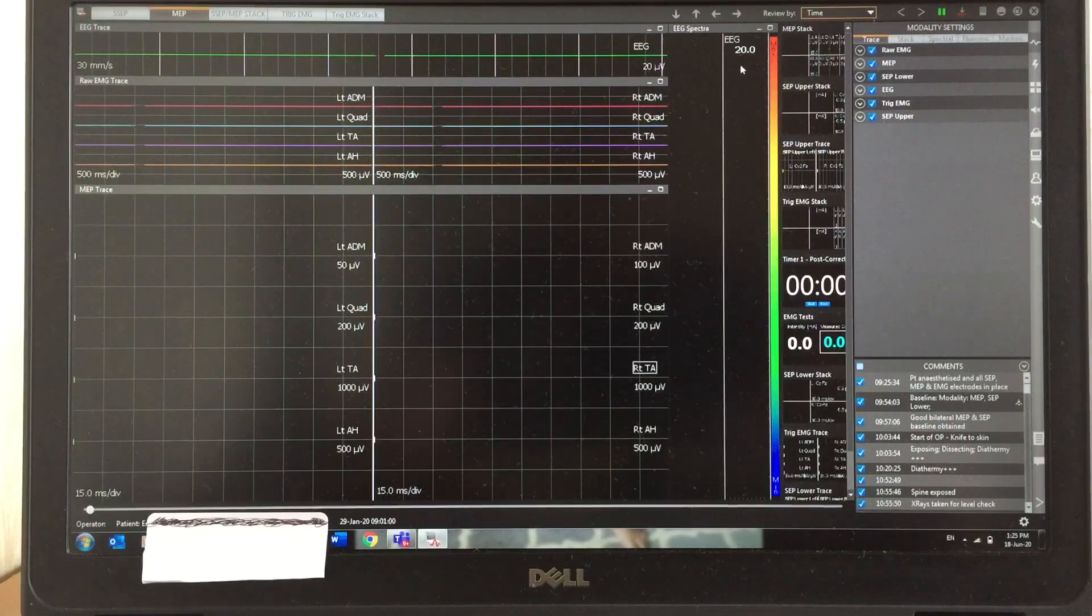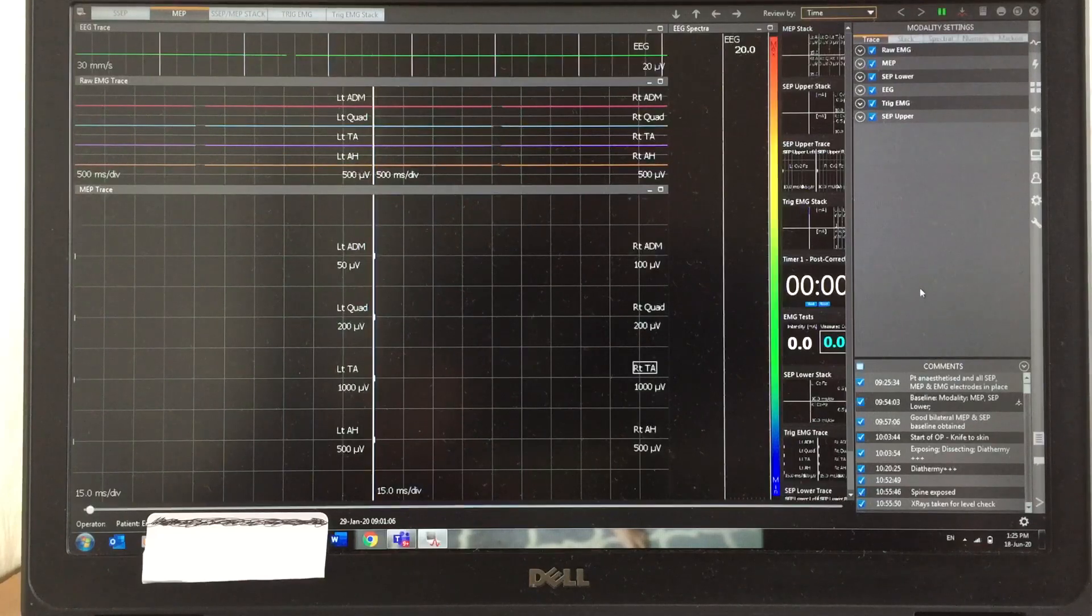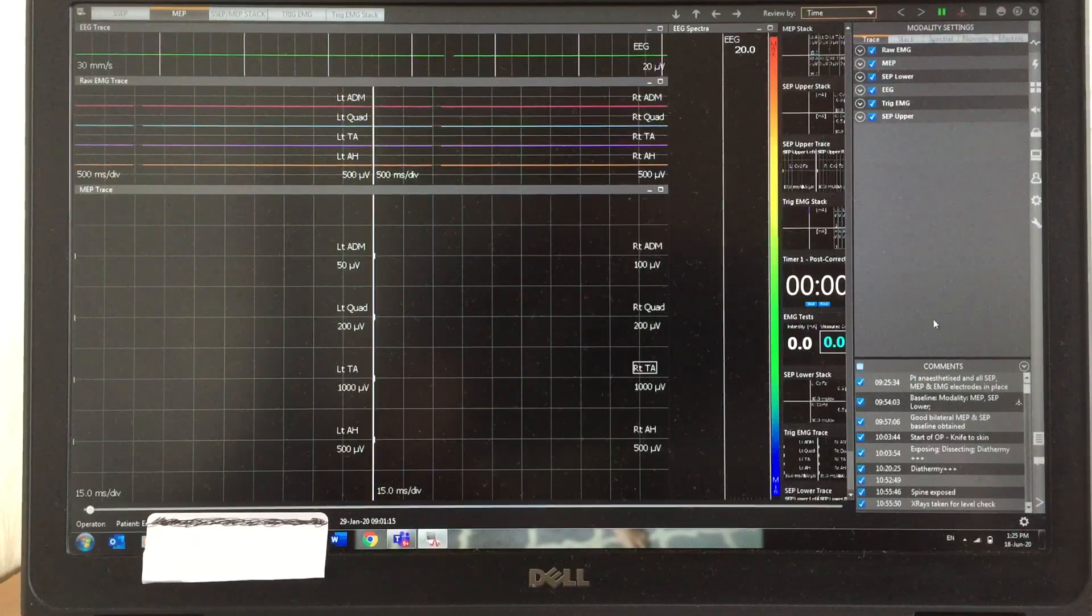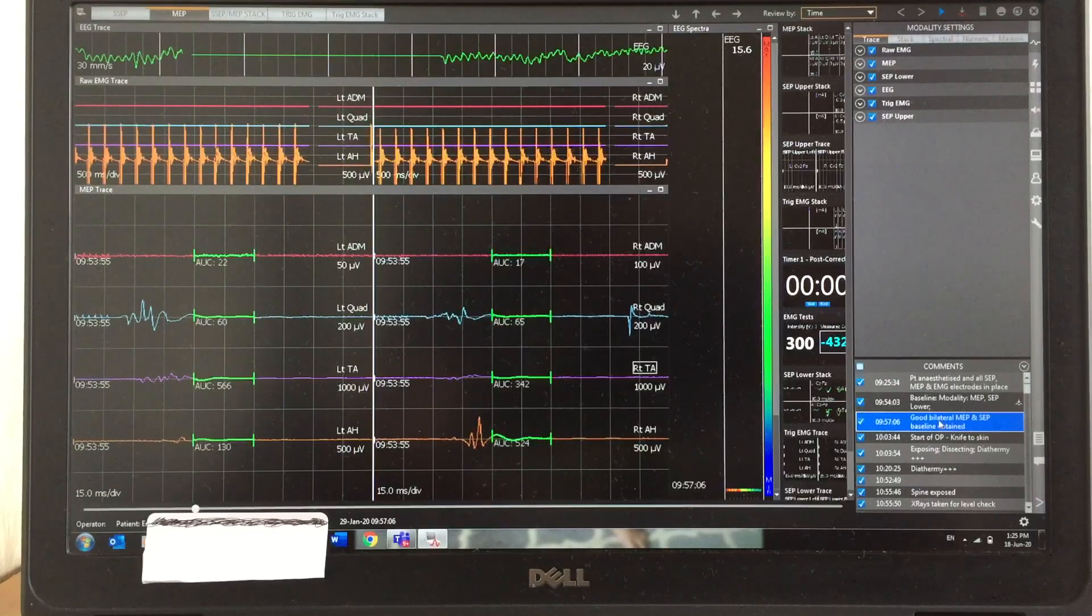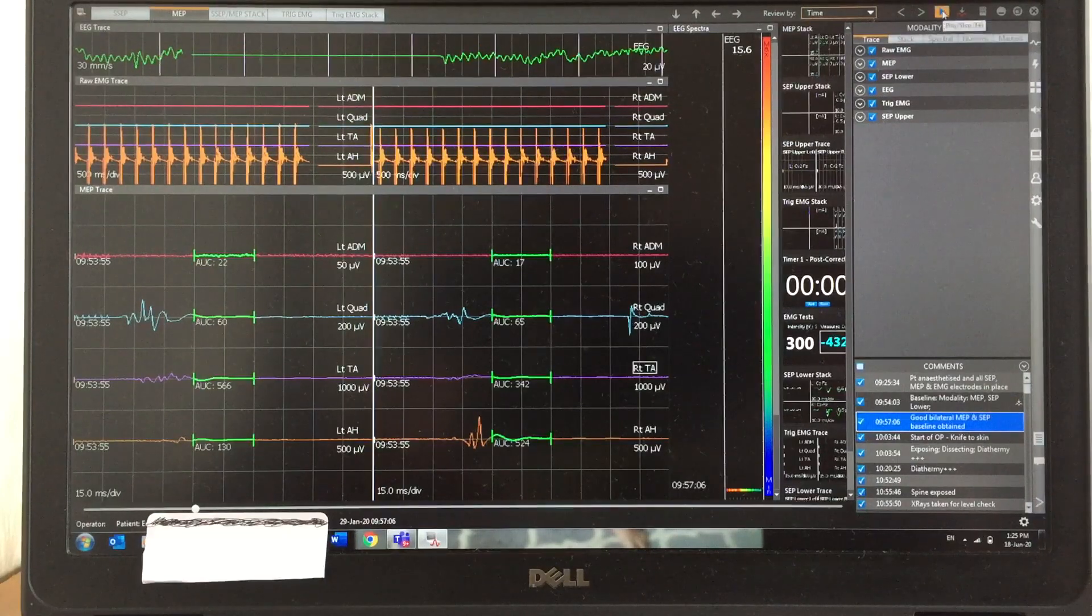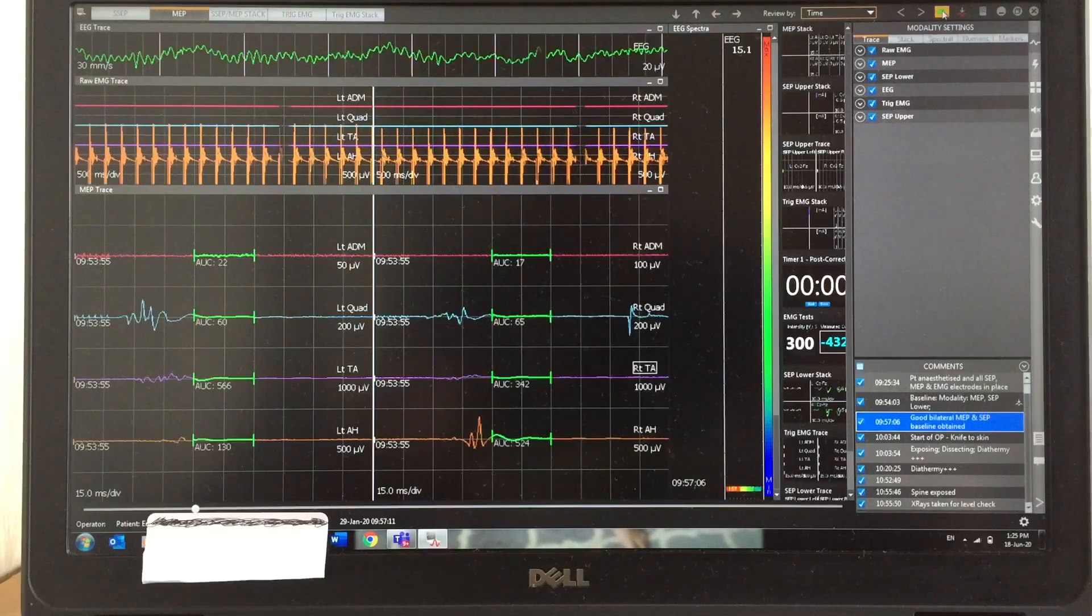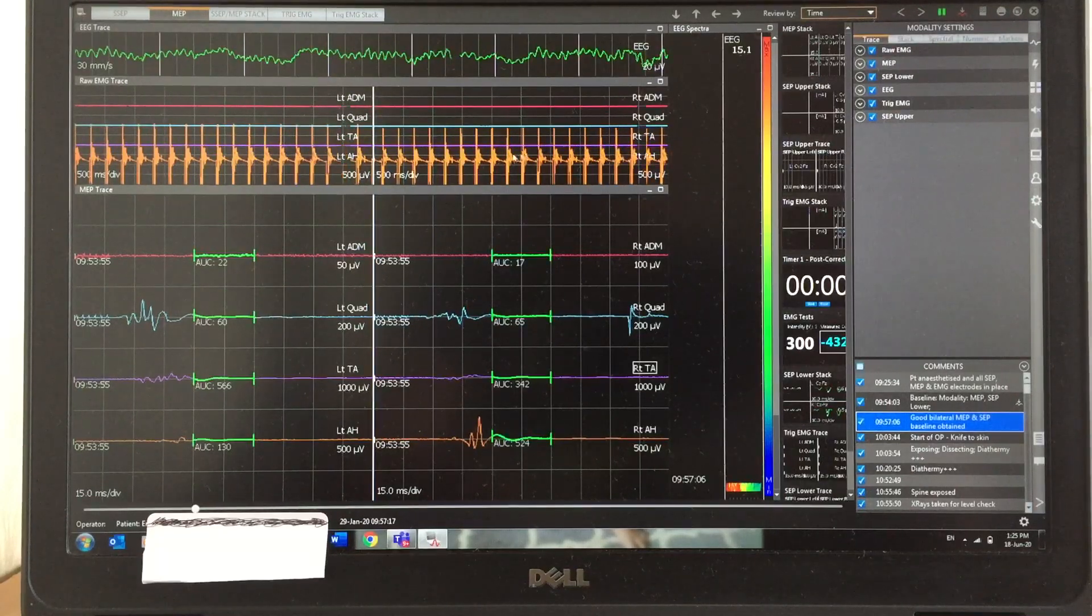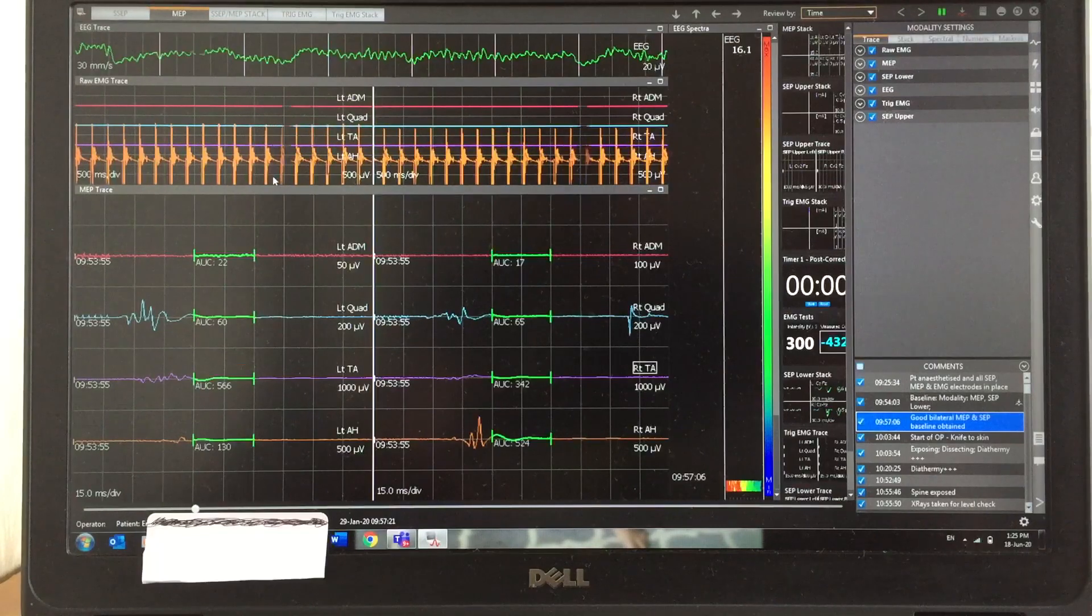Now I'm going to click the baseline. There you can see the baseline. Again I'm going to play so you can see the EEG trace on top, the EMG, and at the bottom you can see the artifact.